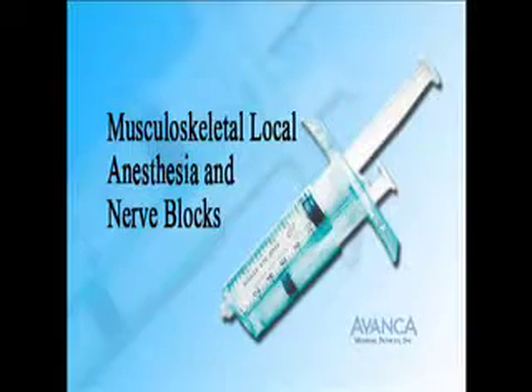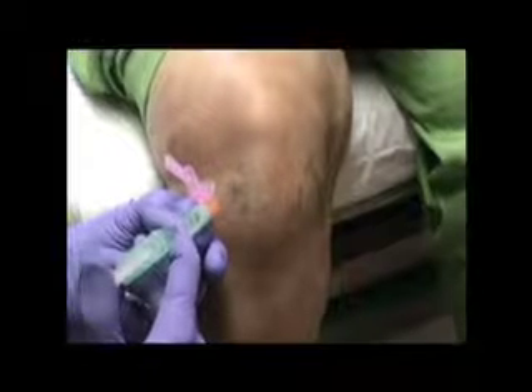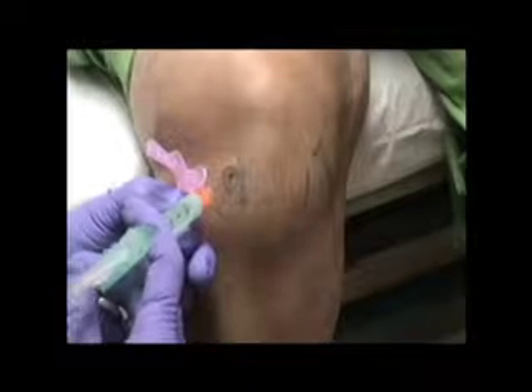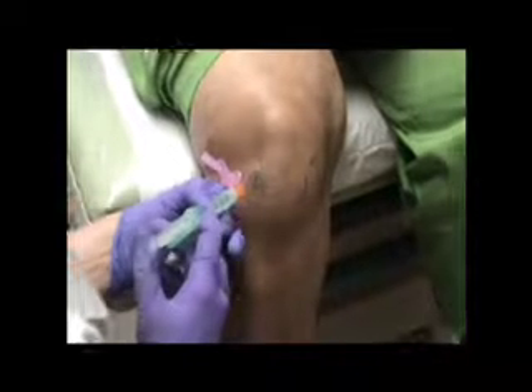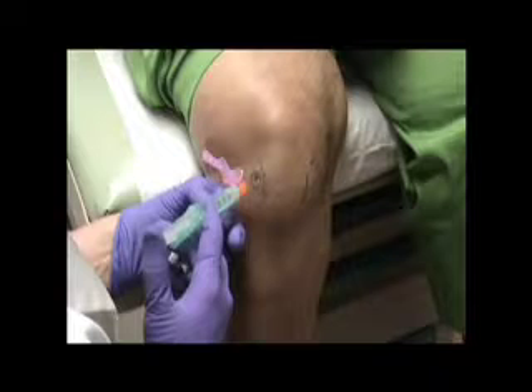Musculoskeletal local anesthesia and nerve blocks. After the local anesthetic agent has been aspirated into the RPD, the needle is introduced into the tissues in a standard fashion. Prior to injecting anesthetic, the RPD is aspirated by pressing the aspiration plunger to assure extravascular positioning of the needle tip.